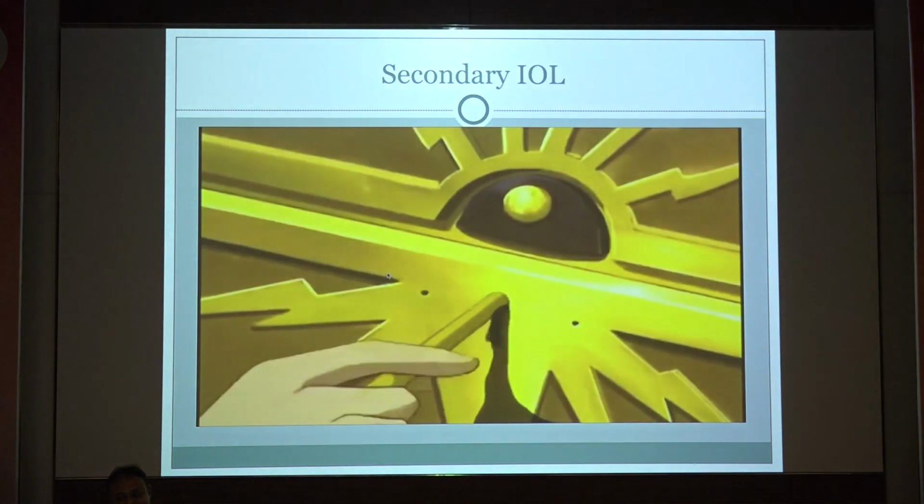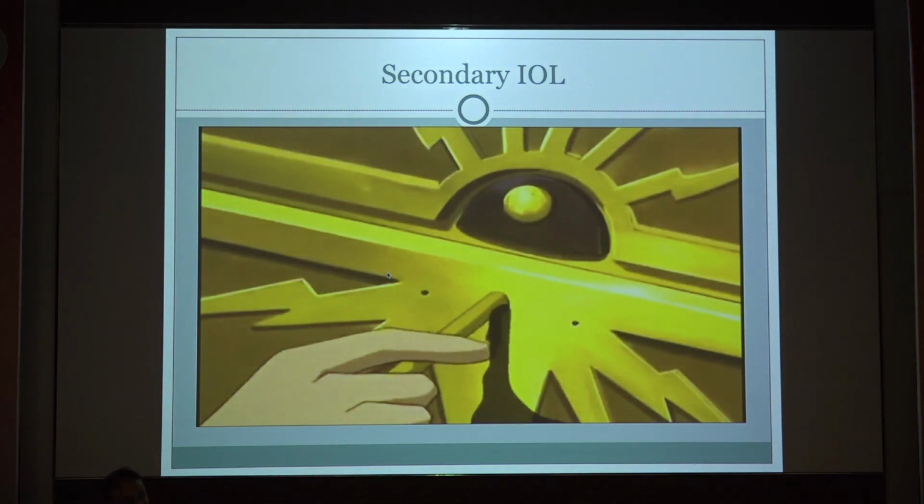Before you start the second video, I think you are lucky that one of the flanks of the IOL didn't injure the retina. No, yes, it fell down also, and it didn't injure. I didn't want to use PFCL at that time because, as Dr. Kelkar also showed in some video, I'm very scared of PFCL. With a little bit more force, it goes here and there, and in an ERM case I didn't want to take any risk, so I didn't use the PFCL there.